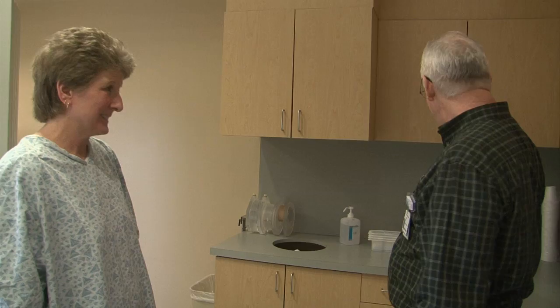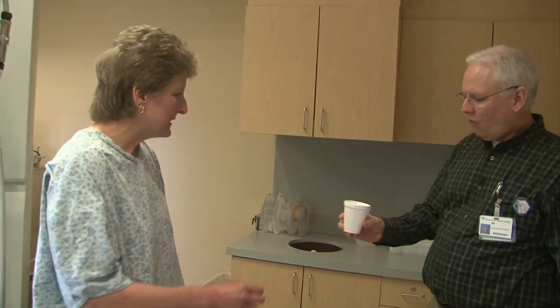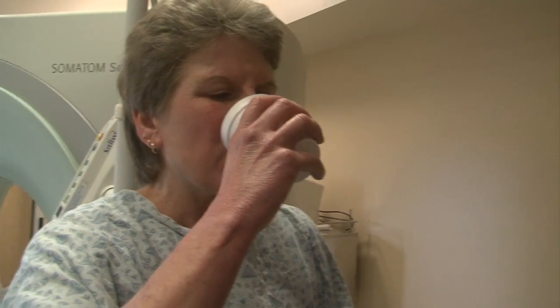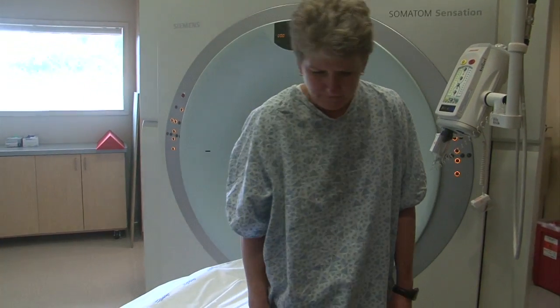Since this exam is with contrast, you probably drank 2 bottles of oral contrast this morning. Well, we have just a little bit more we'd like you to drink. It's about 4 ounces. Oh, I have to drink all that? Yes, I'd like you to drink it all. What this does is it highlights or defines your esophagus and your stomach. Do you have any questions about this exam at all?